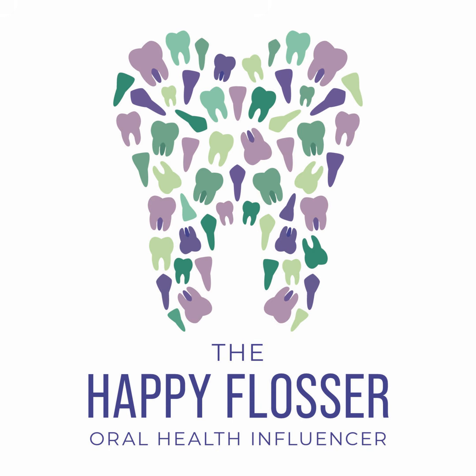If you are missing the apices of the teeth, you will need to make adjustments with your PID so that you achieve visual in those apices. If a full mouth series does not achieve the apices and does not achieve open contacts on the bite wings, then it is not as diagnostic as it needs to be, and you need to make adjustments in your technique in order to achieve that.